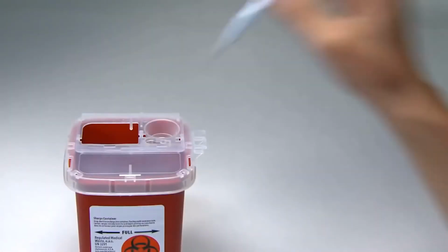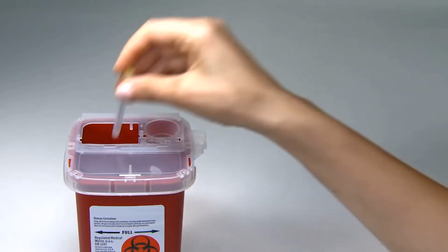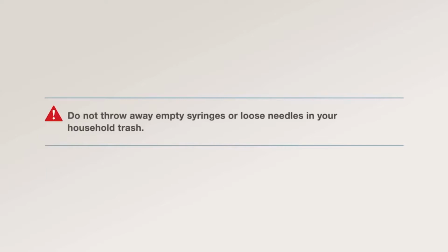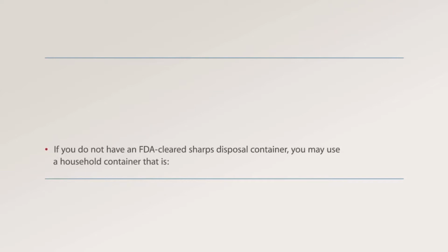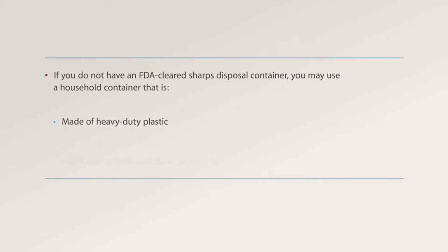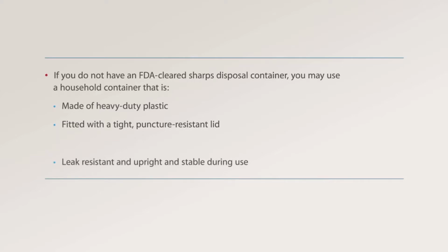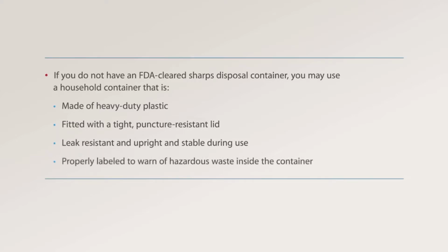Step 4. Disposal. Discard the empty syringe and used needles in an FDA-cleared sharps disposal container right away after use. Do not throw away empty syringes or loose needles in your household trash. If you do not have an FDA-cleared sharps disposal container, you may use a household container that is made of heavy-duty plastic, fitted with a tight, puncture-resistant lid, leak-resistant, upright and stable during use, and properly labeled to warn of hazardous waste inside the container.